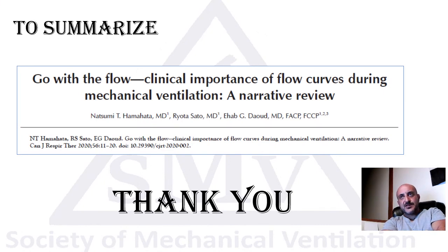So to summarize this talk, sorry if it was a little bit long, I think the flow curves are very important to look at, honestly, more than the pressure or the volume curves. They give you so much information about the respiratory mechanics, the asynchronies with the vent, patient muscle effort, and especially in the weaning process.